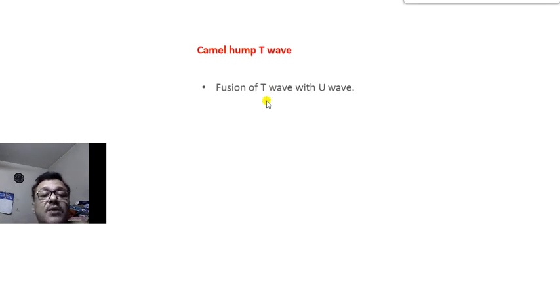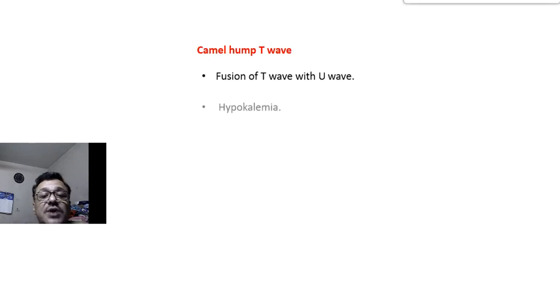Now, camel hump T wave. What is the camel hump T wave? Fusion of the T wave with the U wave. In which condition do we find the camel hump T wave? Hypokalemia and nodal rhythm.